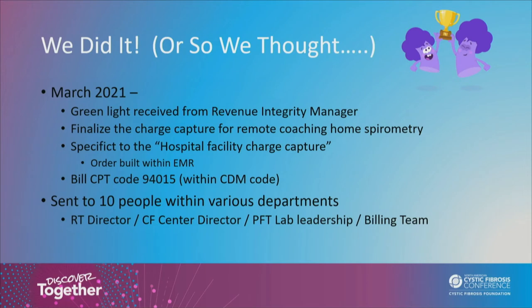This was from our revenue integrity manager. We had the green light to finalize the charge capture for remote coaching of home spirometry that was specific to the hospital facility side. And within that charge capture, an order was incorporated through our EMR system. So whenever our providers would schedule the remote coaching session, an order was supposed to automatically drop. And we opted to use the CPT code 94015. That was the CPT code that was built within the CDM code.